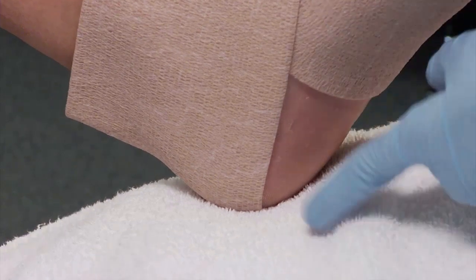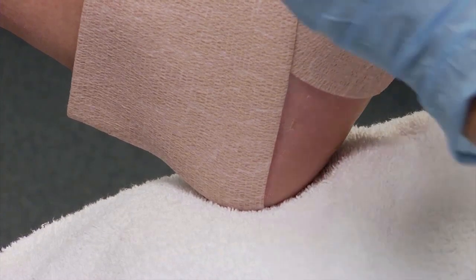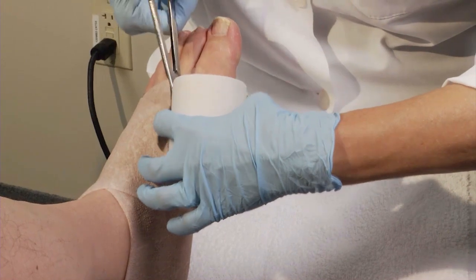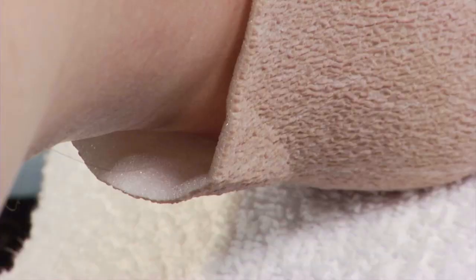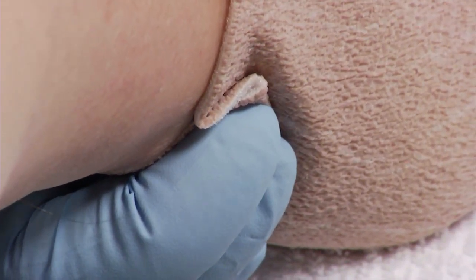In most cases the posterior plantar surface of the heel is not completely covered. Complete coverage of this area isn't necessary, as it requires an extra winding over the ankle joint and would make the total application unnecessarily thick and less comfortable. Cut the bandage and gently press it into place. On a leg with a narrower ankle there may be a small fold of comfort layer material in the Achilles area. This is normal — guide it off the Achilles area into the natural depression behind the malleolus. It will lay down smoothly when the foam compresses with the application of the compression layer.